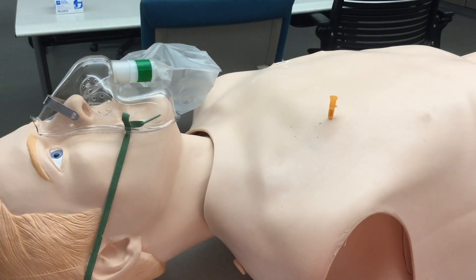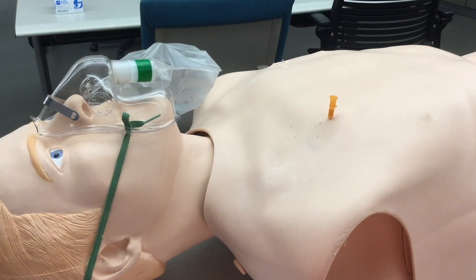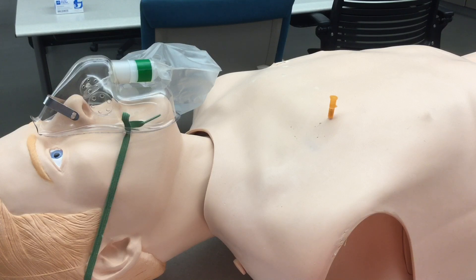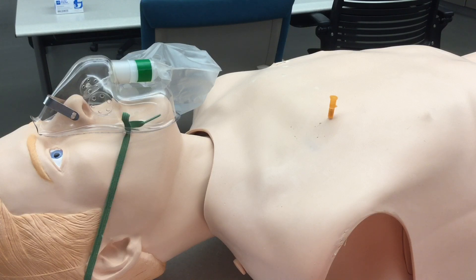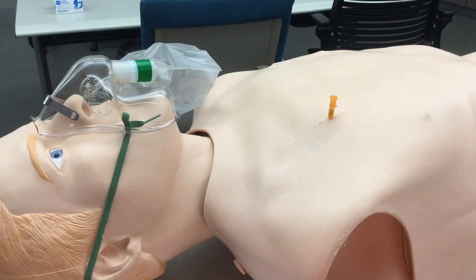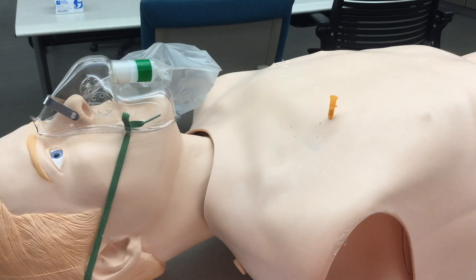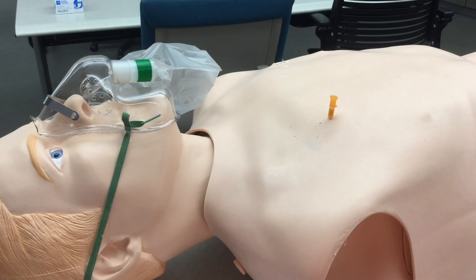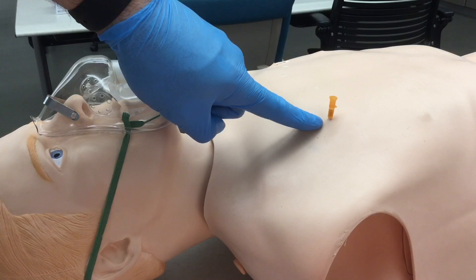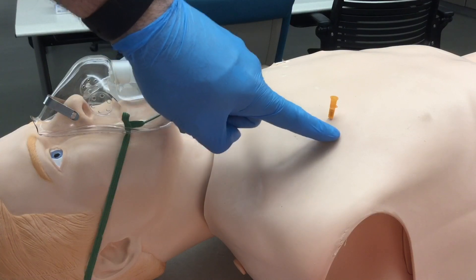After an appropriate length of time, reassess your patient looking for signs of improvement: improved breath sounds, equal chest rise and fall, improving lung sounds, and improving blood pressure. If your patient deteriorates and you suspect a recurrence of the tension pneumothorax, leave the original catheter in place and perform a second decompression lateral to the first.